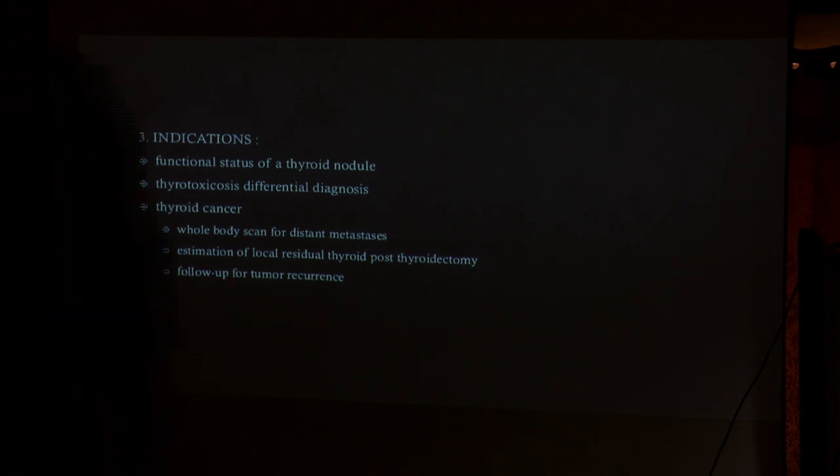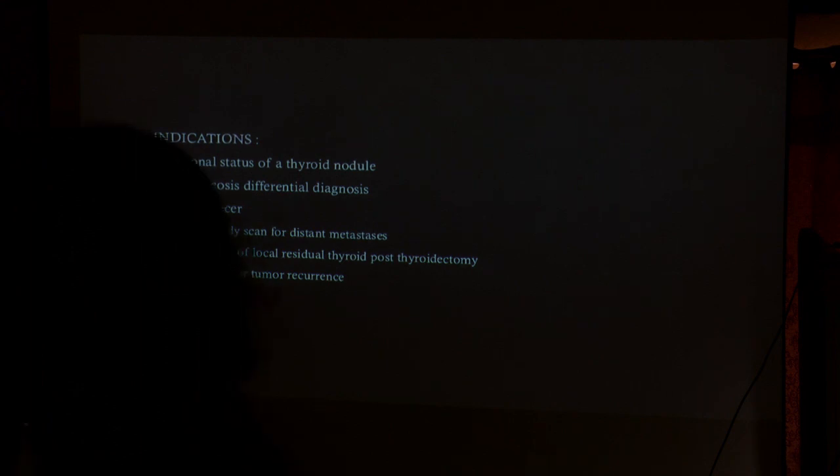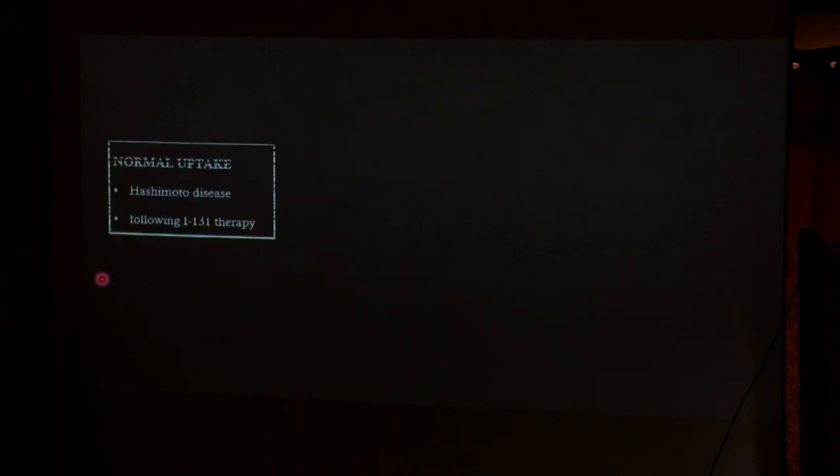Indications, again, for this scan is going to be to know the functional status of the thyroid nodule. Is it a hot nodule? Is it a cold nodule? And the differential diagnosis of thyrotoxicosis, as well as in cases of thyroid cancers to look for distant metastasis.